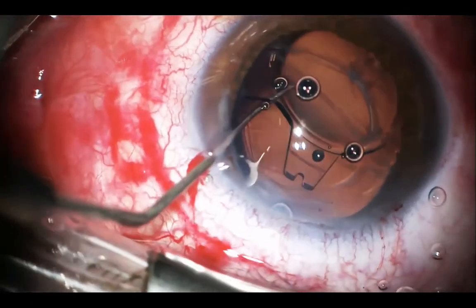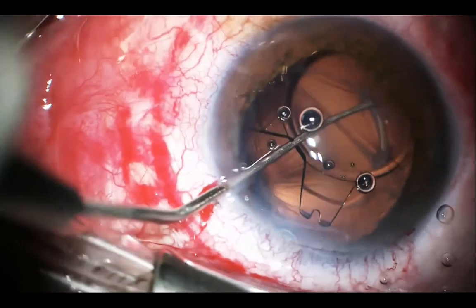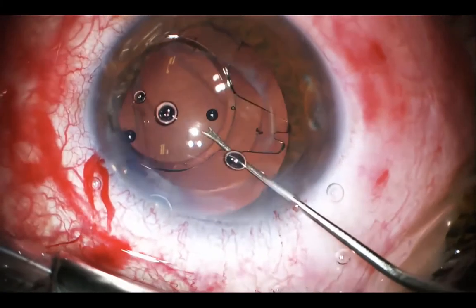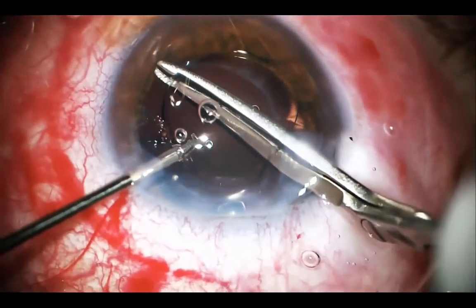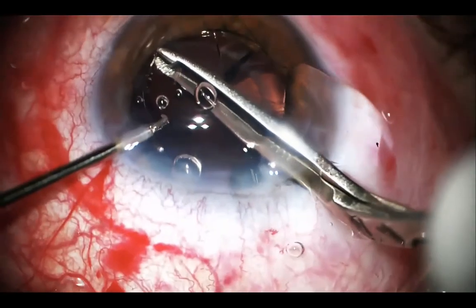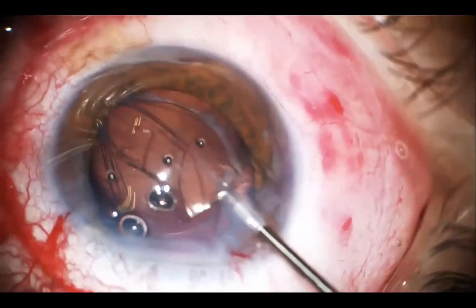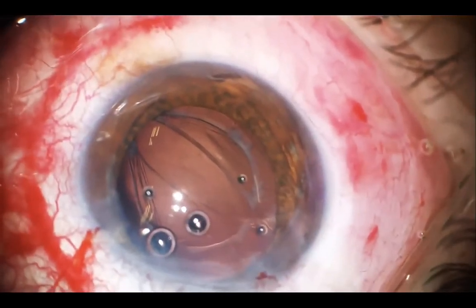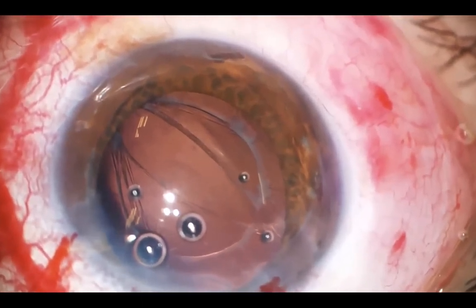This is a single-piece lens, and this lens is designed to be implanted within the capsular bag. So it's contraindicated to implant this lens in the sulcus because it carries a high incidence of UGH syndrome, or UGH syndrome, and the patient, as you have seen here, has been complaining of uveitis, glaucoma, and sometimes hyphemia in other patients. So a decision was made to remove this lens, and now we are ready for implantation of a 3-piece lens inside the sulcus.